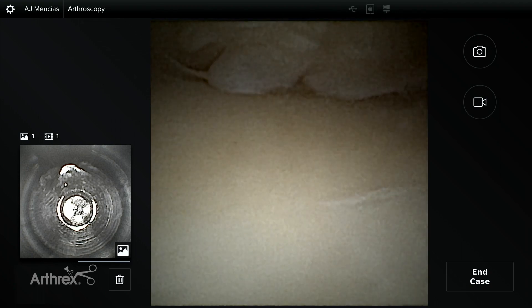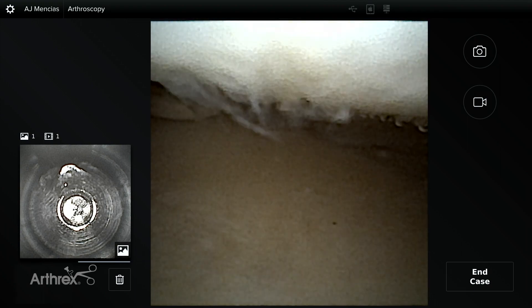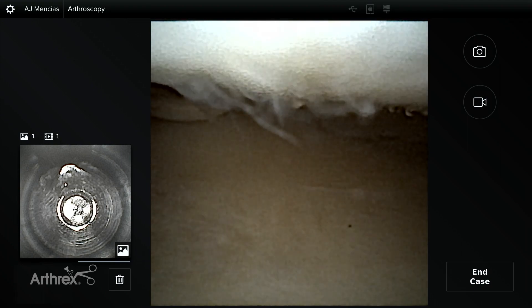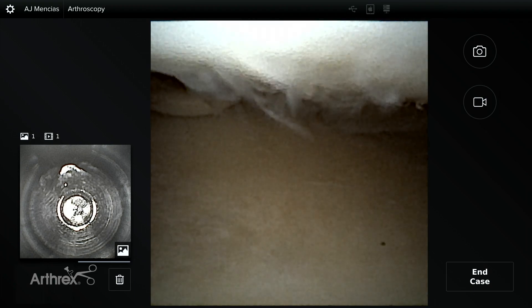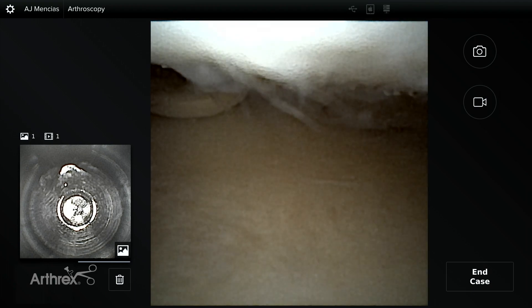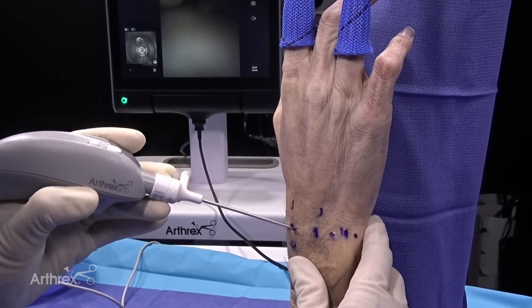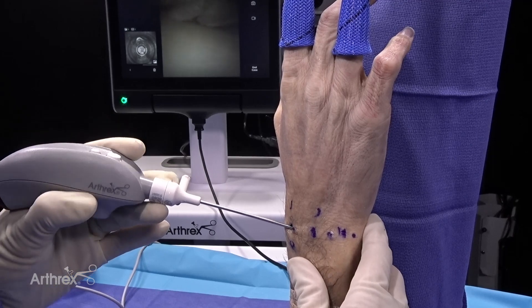As you can see down here inferiorly and proximally, this is the radius articular cartilage — a fairly healthy specimen. Right above us there's a little fibrillation; you can see this is some grade two chondromalacia of the scaphoid. You can see this so clearly in a manner that you've never been able to see it with a standard 30-degree scope. You're looking directly at the fibrillated cartilage.